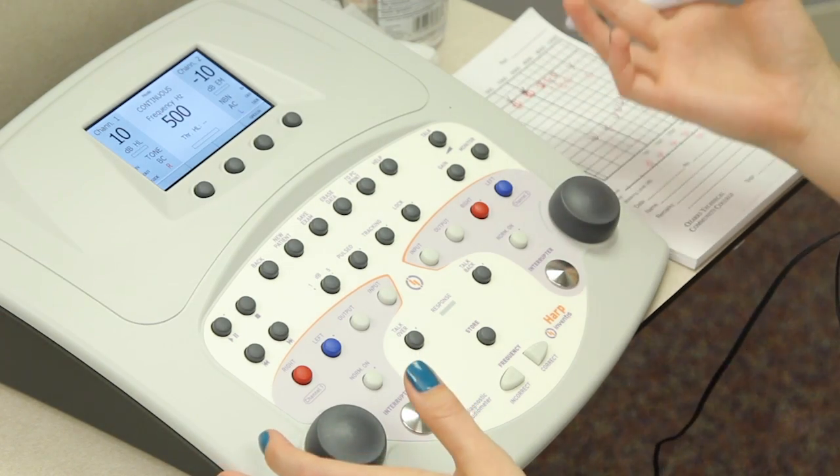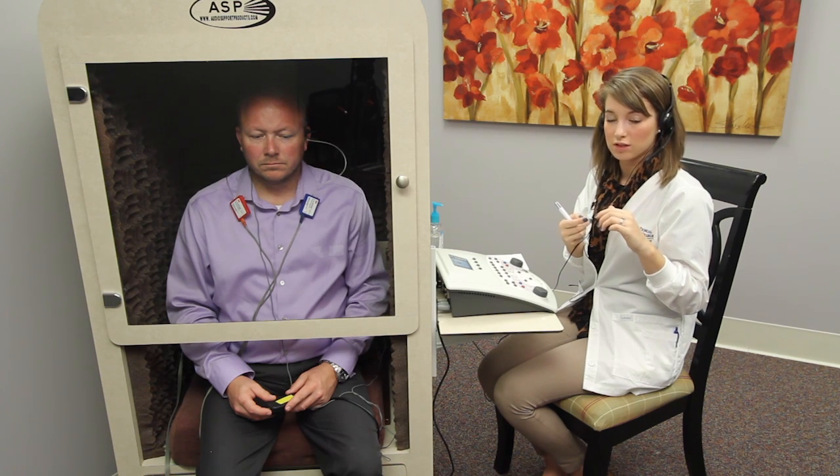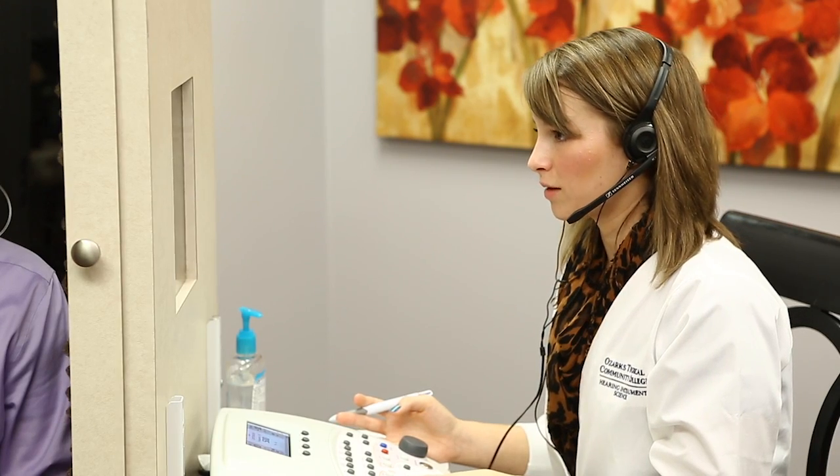Now what we would do would be to switch the oscillator and move it to the left cochlea, occlude the right ear, put masking into the right ear, and go ahead and test the left ear. For the purposes of this video, we aren't going to do that. We're done with that test, and that concludes bone conduction testing.